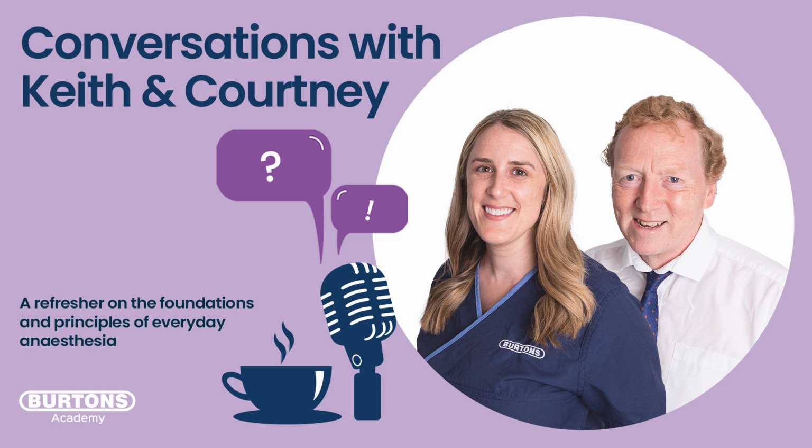Personally, practically, I just turn that flow up in my circle system to like 2, 3, 4 liters per minute. And then I make a note. I put little wee asterisks on my anesthetic record, and that's when I know that I can readjust and go back down to a nice normal maintenance flow of about 0.5 liter per minute for most of my patients under anesthesia.